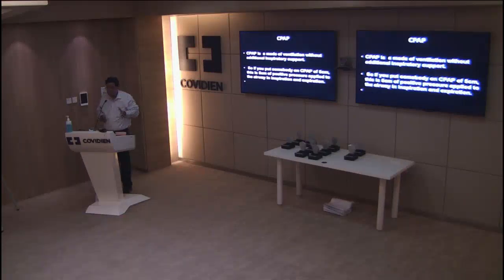That's the main difference. And when IPAP is equal to EPAP, that means there is no pressure support given. Pressure support is 0. So when pressure support is 0, IPAP is equal to EPAP. Then we call it continuous positive airway pressure or CPAP. You understand? Basically it means giving PEEP without any pressure support. The patient is breathing spontaneously. That's called CPAP. Okay. I don't know whether I made it more confusing for you all, but basically it means giving PEEP without any pressure support. So when the pressure support is 0, IPAP is obviously equal to EPAP.